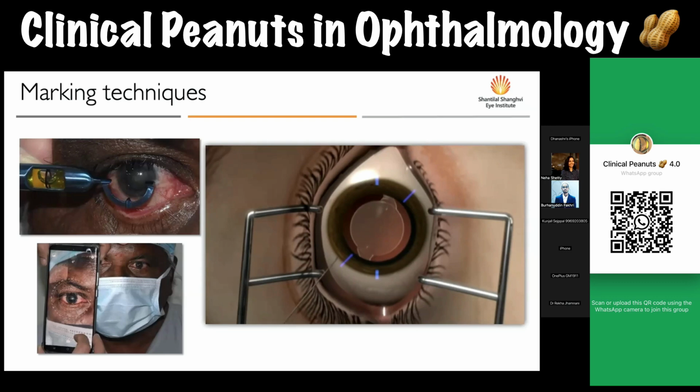Surgeon aligns the marks on IOL gently with previously marked axis on cornea to get desired post-operative visual outcomes. Before sealing the wound, surgeon compresses the lens to back of capsular bag to ensure that the lens remains in desired place.